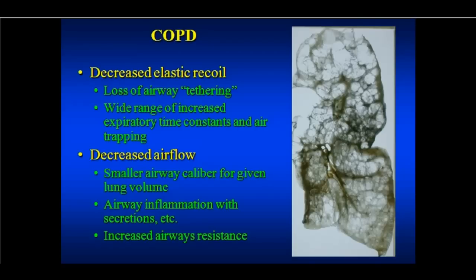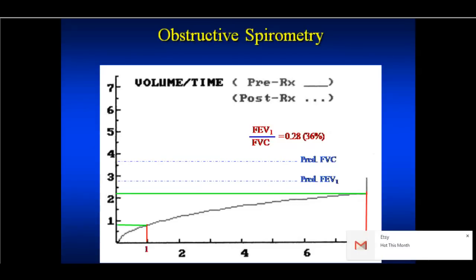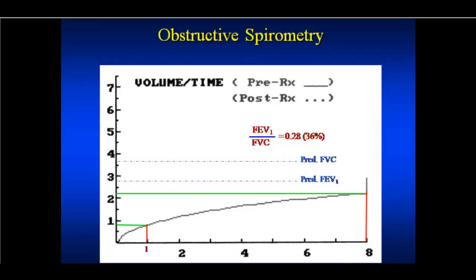All right. So this is an individual who has obstructive spirometry or airflow-limited spirometry, which is a better physiological term. This is a veteran. Again, we see a spirogram. You can see already that the configuration of this line is much, much different than the healthy individual. The predicted FVC is here, up to your right, and what this person actually did is here on the green line. Now, what you'll notice is that on people that have long time constants, a long time to get the air out, you don't see a plateau.